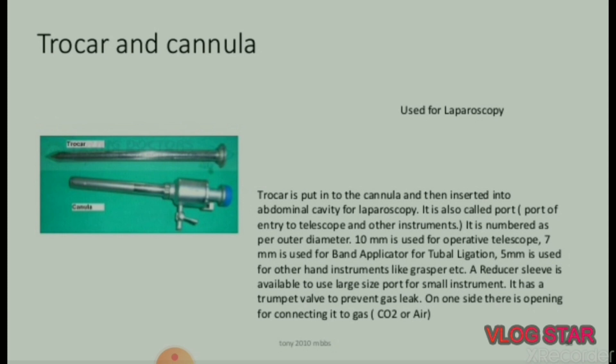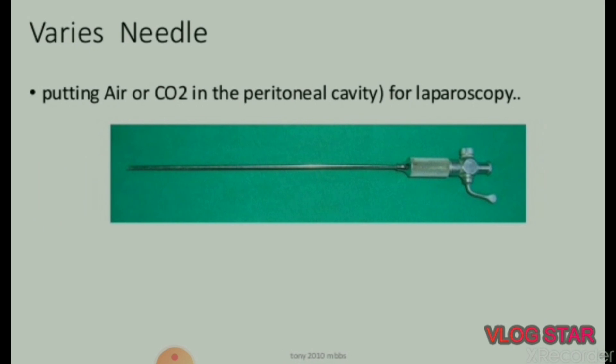Next instruments for laparoscopy. Trocar and cannula: the trocar is put into the cannula and then inserted into the abdominal cavity. It is also called the port — port of entry for the telescope and other instruments. Numbered as per outer diameter: 10 mm is used for the operative telescope, 7 mm is used for band applicator for tubal ligation, 5 mm is used for other hand instruments like grasper. A reducer sleeve is available to use a large-size port for smaller instruments. It has a trumpet valve to prevent gas leak, and an opening for connecting to gas (carbon dioxide or air).